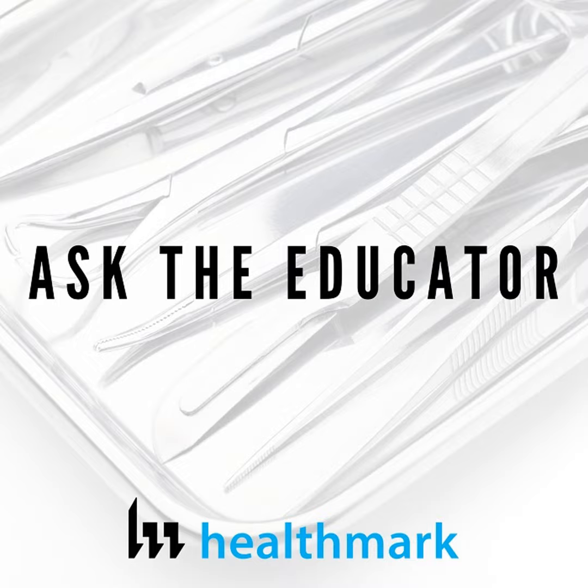I'm trying to think of the things because we had a policy when we instituted it. So, going back to your point about the clean side versus the dirty side, whenever somebody says, where should I put my borescope? I always recommend they go on the dirty side, because you want to be able to see those things as soon as possible. If it's dirty and it goes to the clean side and you inspect it and see that it's dirty, that's better than letting it go to the OR, right? Yeah. But it's still not the ideal scenario. You want to be able to catch it in decontam, clean it immediately, and then it's safe to handle on the other side. So we had a policy based around our borescope.